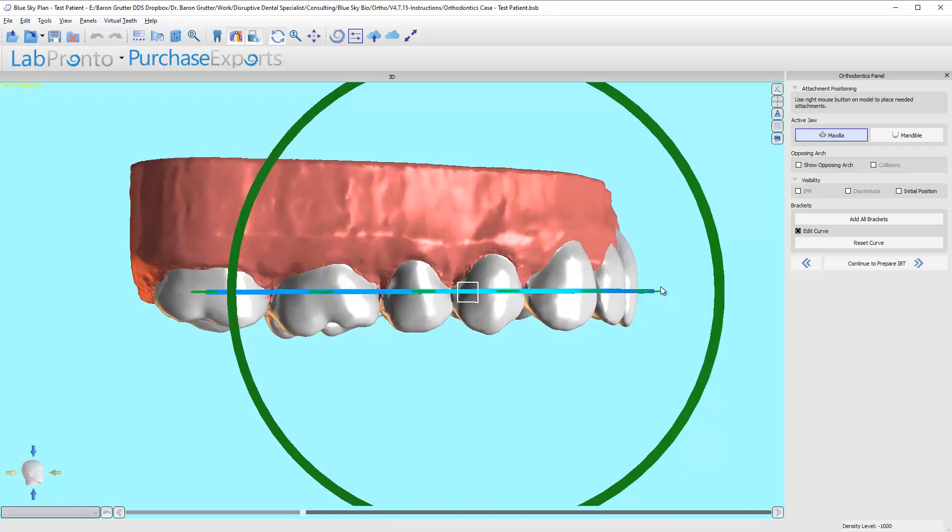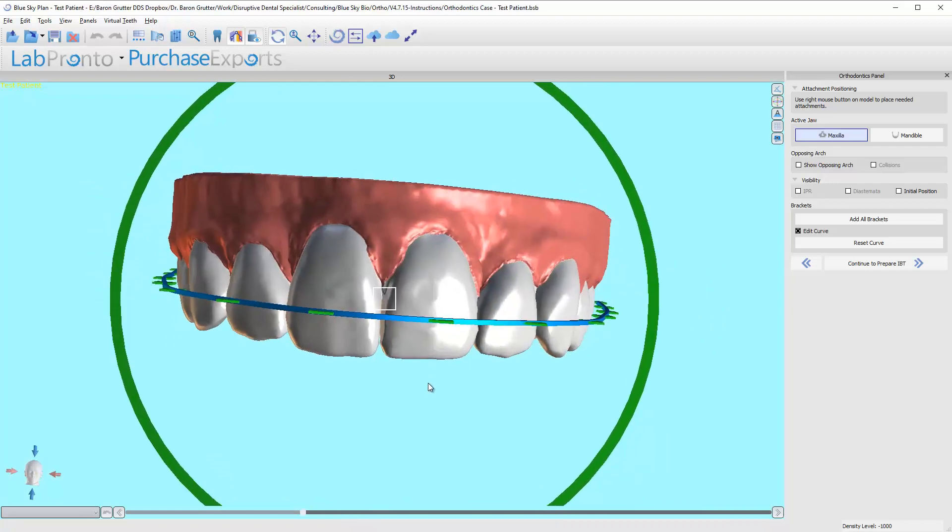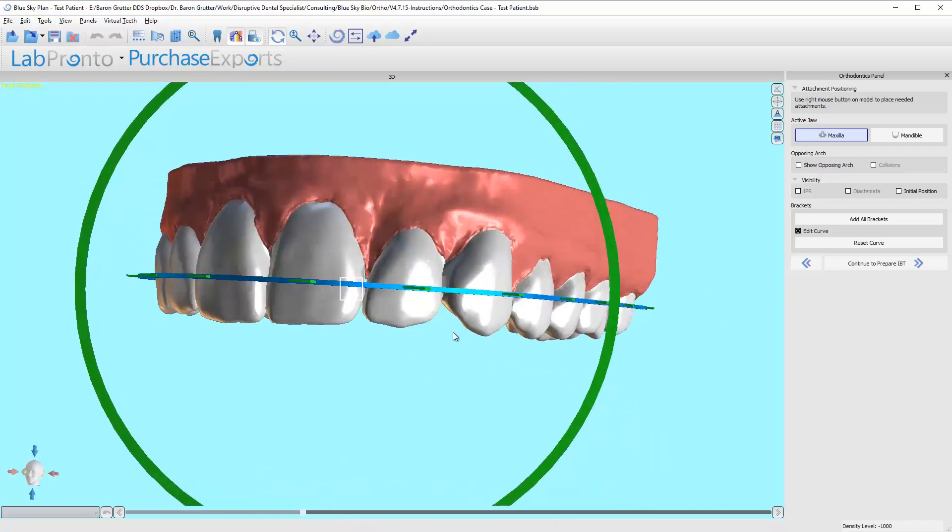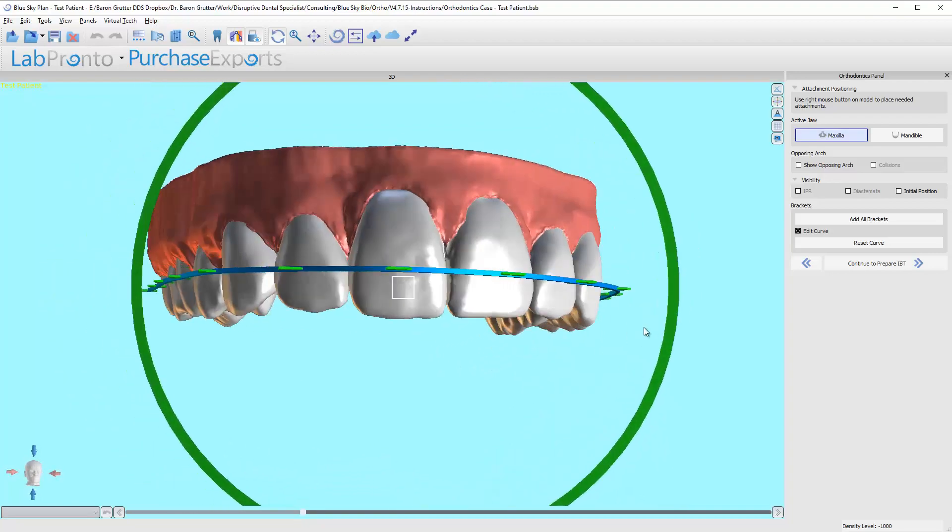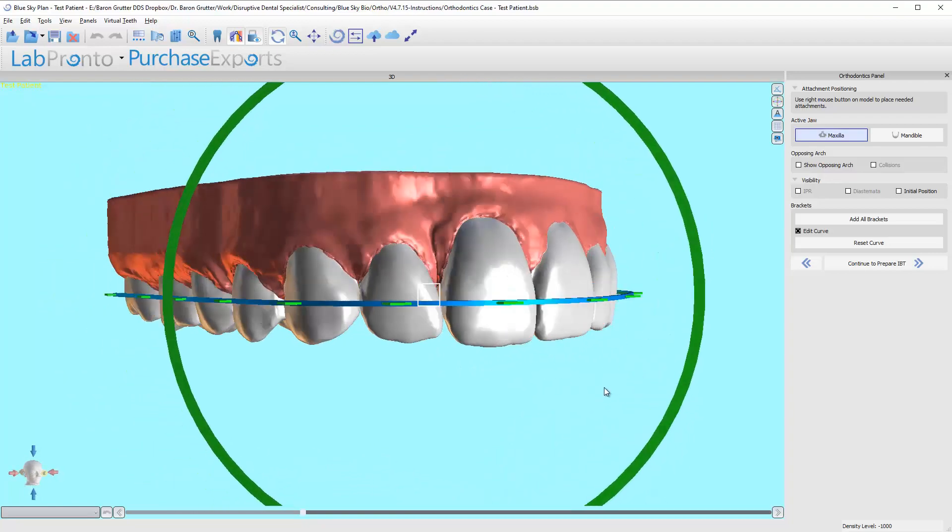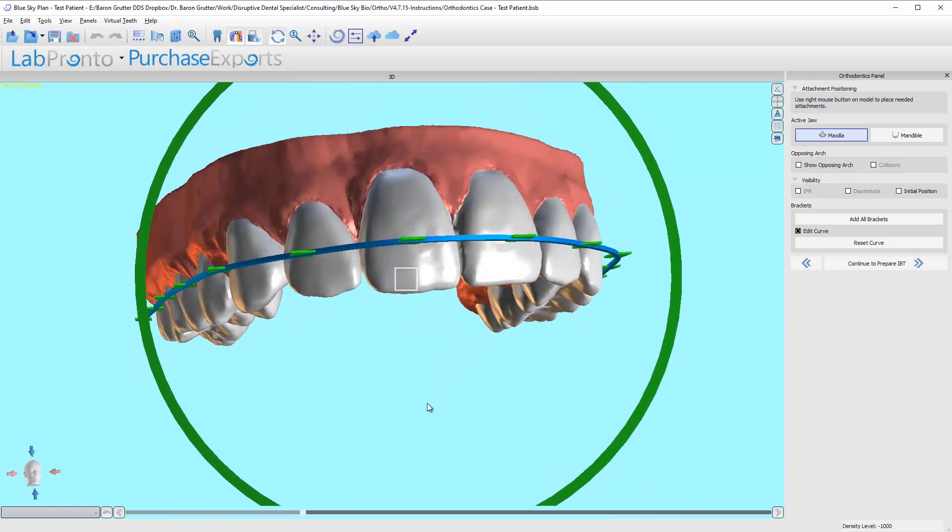Now you might think, well these are supposed to be higher here and these are supposed to be lower. It doesn't matter because the wire itself is going to be straight. So there is no perfect position by measurement by teeth. This is all about relative to one another, so as the wire straightens out, they all straighten to this final desired position.